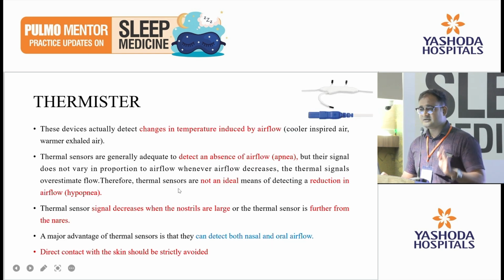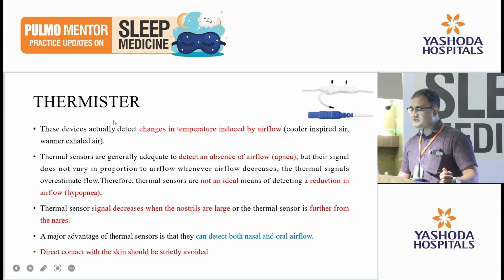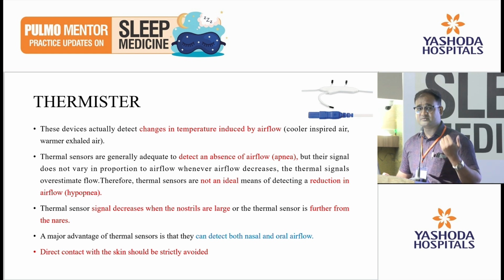Coming to thermistor, try to understand the difference between thermistor and nasal cannula. This thermistor detects the changes in temperature induced by the airflow. That is cooler inspired air that we are taking inside the body and warmer exhaled air.